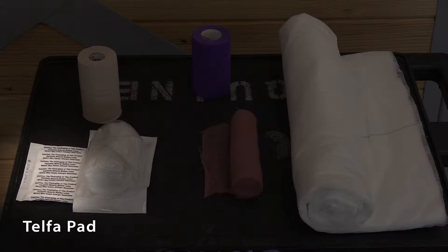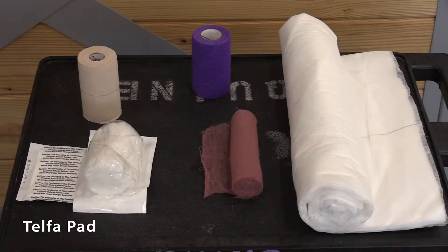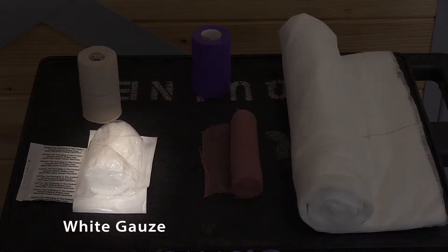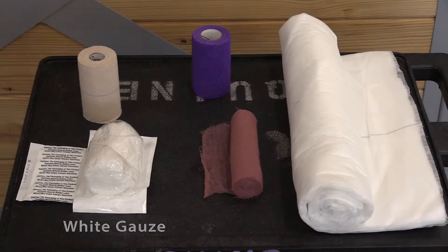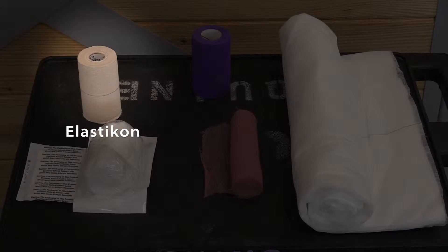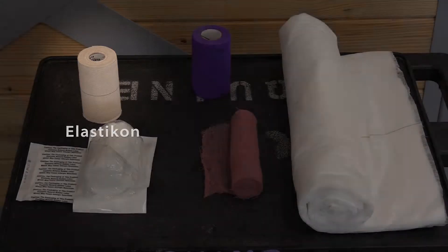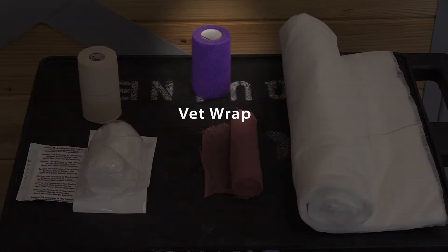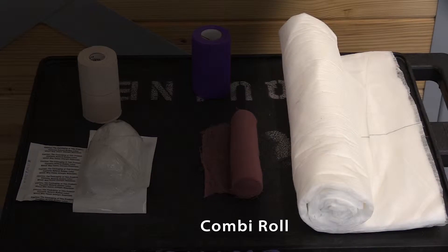Materials used will be underlying material for the wound. That would include a Telfa pad or a non-adhesive bandage material that would go over a wound, held intact on the leg with a stretch-type gauze — which we call white gauze — that has a little bit of stretch to it. Elasticon is used for sealing the bandage so material or debris cannot get into the inside of the bandage. Brown gauze, vet wrap, and combi roll or leg cotton.